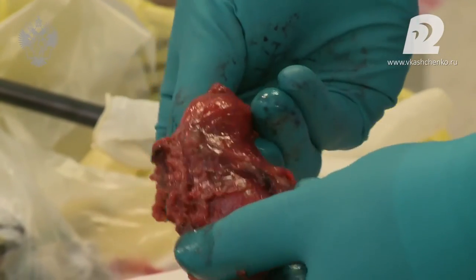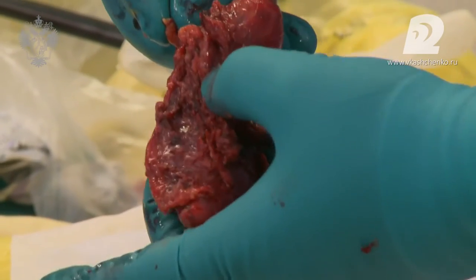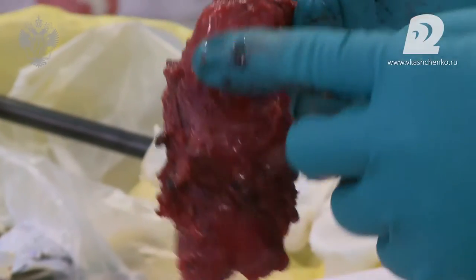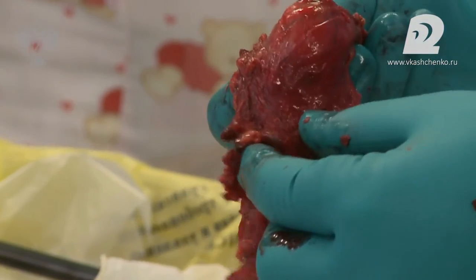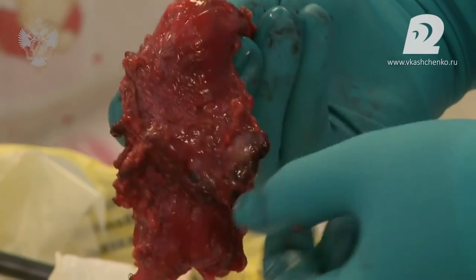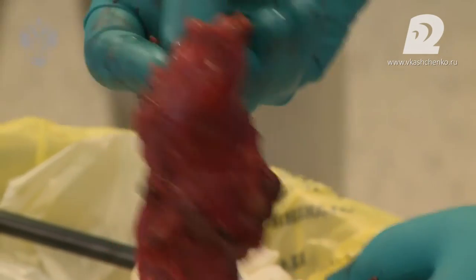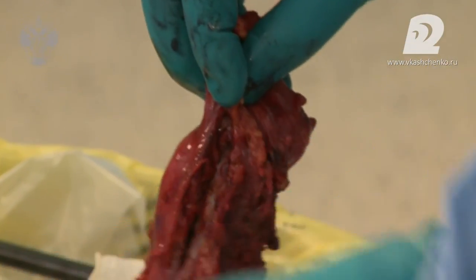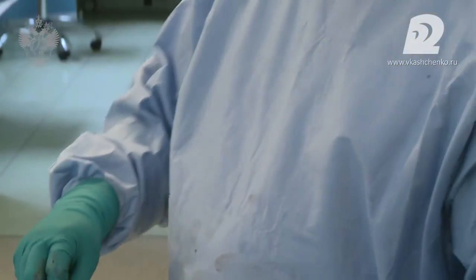Yes, of course, the doctor asked quite a reasonable question, but I actually thought that this specimen must be removed quite drastically. You can see that I retained just the surface of it, and at the moment we are going to have the lymph nodes also removed separately. So I hope that I answered your question.